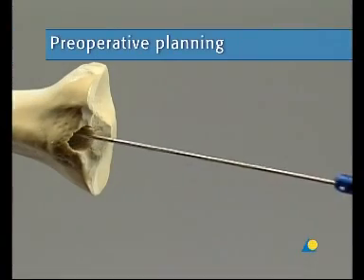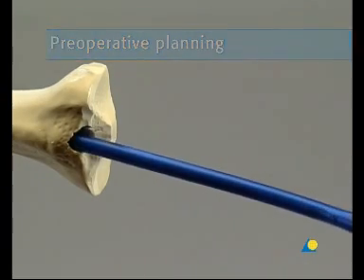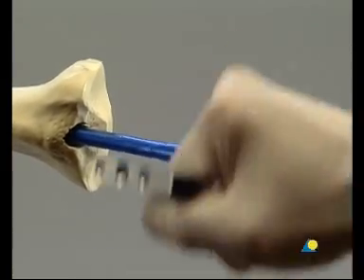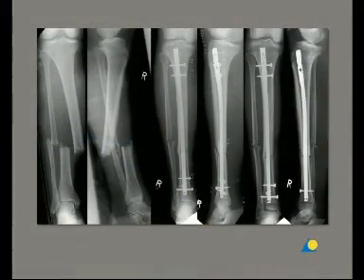The expert tibial nail can be inserted into the medullary canal either with or without reaming. In this presentation, reaming will be demonstrated. The nail will be inserted over the guide wire. With simple shaft fractures, four medial lateral locking screws are normally sufficient — two distal and two proximal.